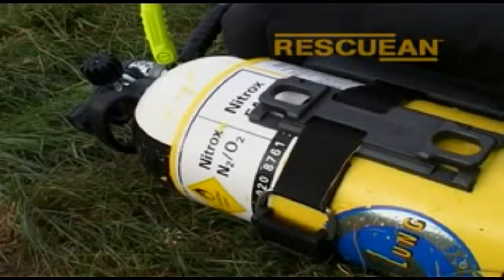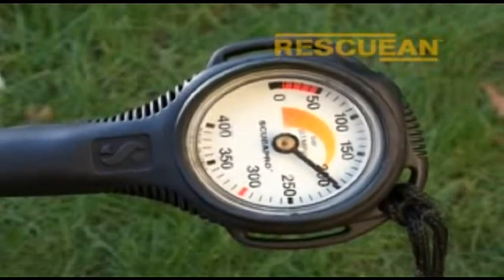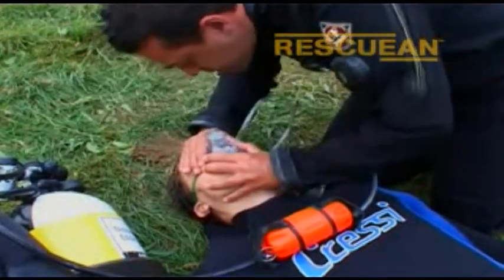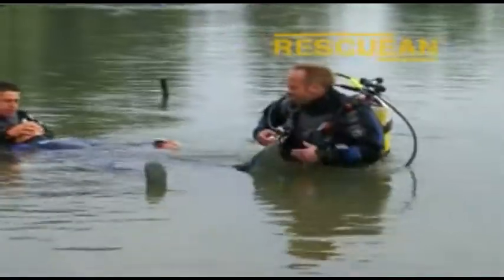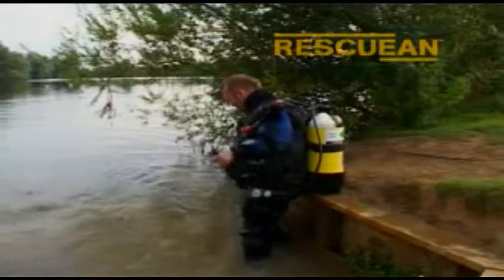You can monitor the cylinder's remaining nitrox by using the pressure gauge on the high-pressure hose. Commence or recommence EFR mouth-to-mask rescue breaths. As you can see in this real-time scenario, the Rescue EAN pod becomes an essential part of a rescue diver's kit.